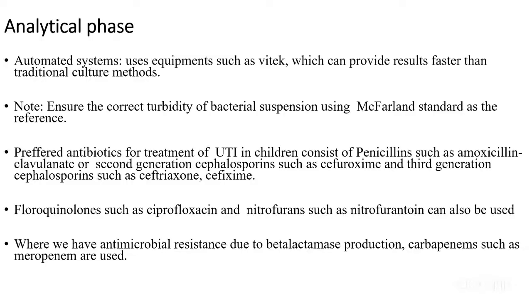Because, let me give an example of a gram-negative. Let's say you want to use vancomycin on E. coli. This drug will not work because these bacteria have a peptide lipopolysaccharide layer that will not allow this vancomycin to penetrate through. Because this vancomycin drug is a large molecule and it's hydrophilic. So this drug will not work for the E. coli. That's why it's important when you are running an AST, know the kind of organism that you have, check your standard, check which drugs work for which organism, then do the ASTs.